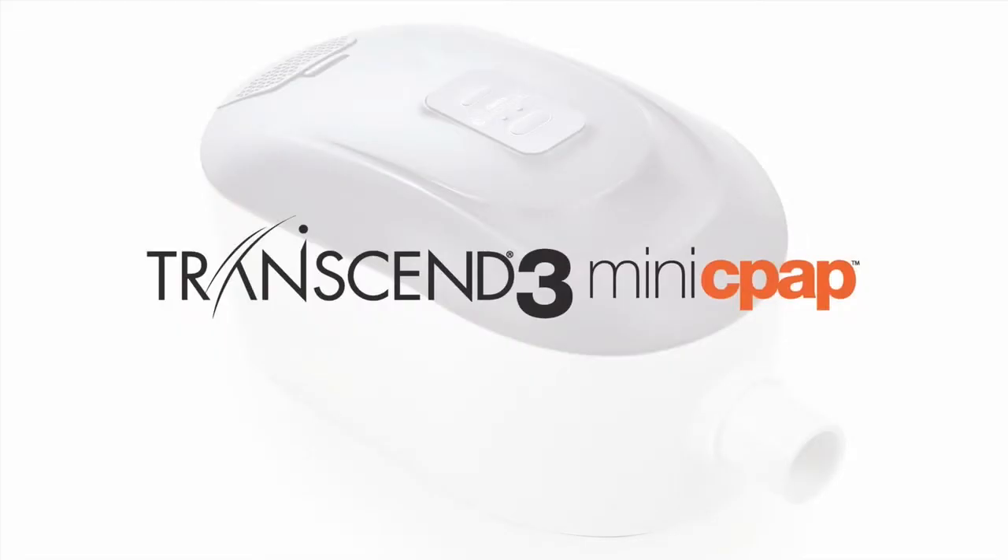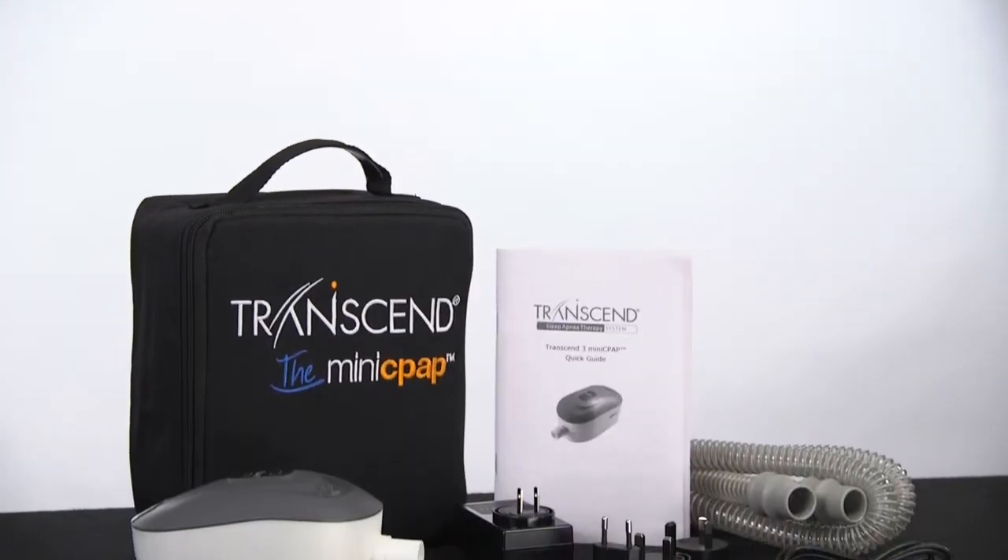Today, we are going to look at the new Transcend 3 Mini CPAP from Somnetics.